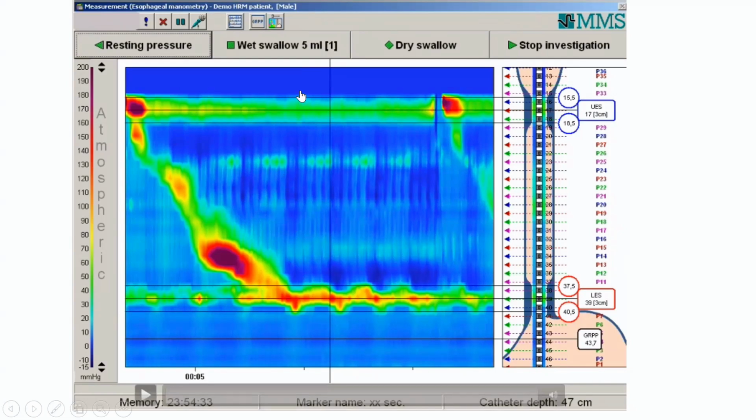Is the swallow being done correctly? Is the patient doing a double swallow or coughing or sneezing or whatever, the things that we covered in our last webinar? Only then can you actually go on to measuring the key parameters that are essential for the reading of the manometry.